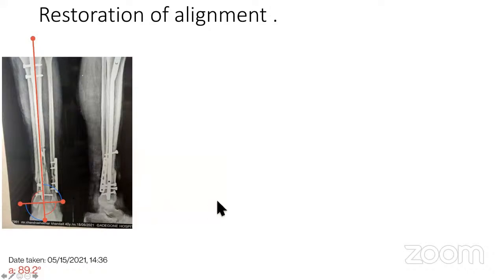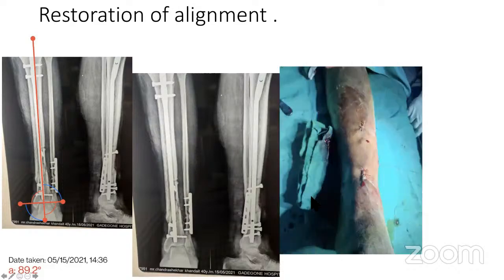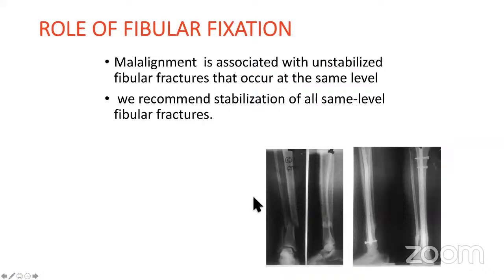I can show the X-ray also, it is available with me. And this is how it is. You can see the restoration of the axis in both. And this was a very small incision through which I did the osteoclasis. And this is how it is, and from this the fracture has completely healed.